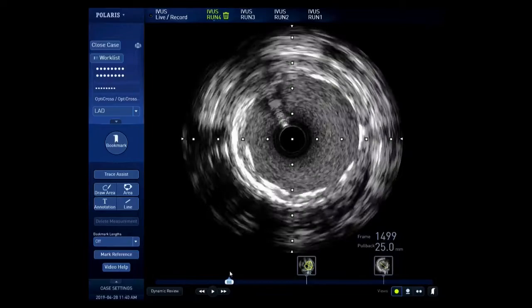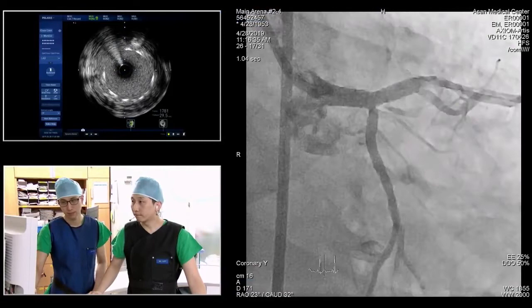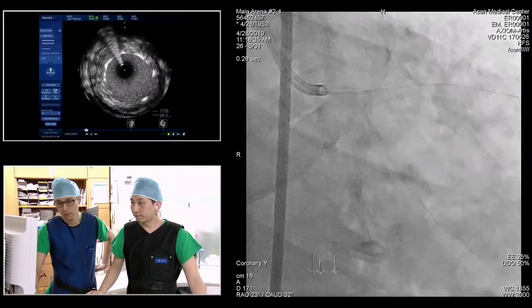It's underexpanded, kind of. Yeah, it's really underexpanded, we're saying. It's a good lumen, but it still looks underexpanded. And you've got a lot of malapposition at the proximal edge, which makes you worry about if you ever have to rewire, getting behind the stent. Yes. And you did lose the intermediate. Yeah, the intermediate. I don't know if you're completely done.